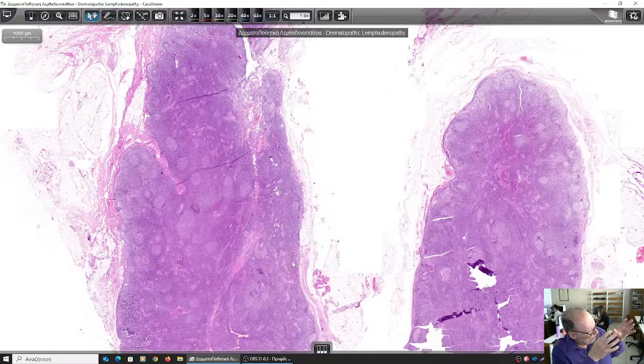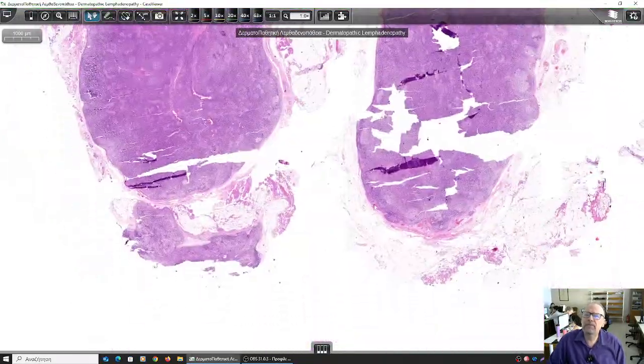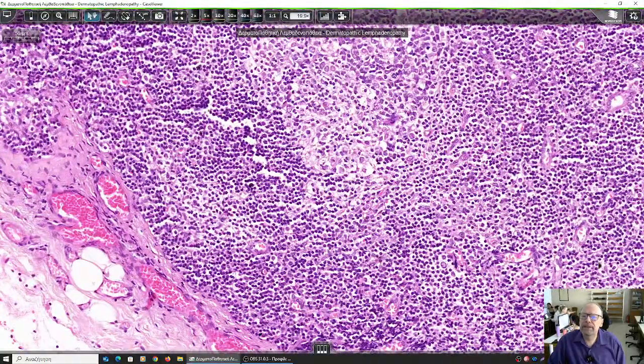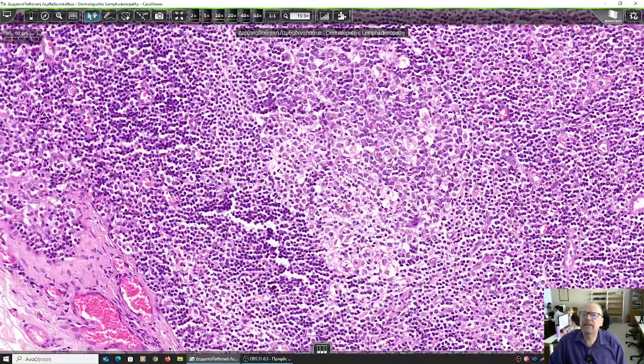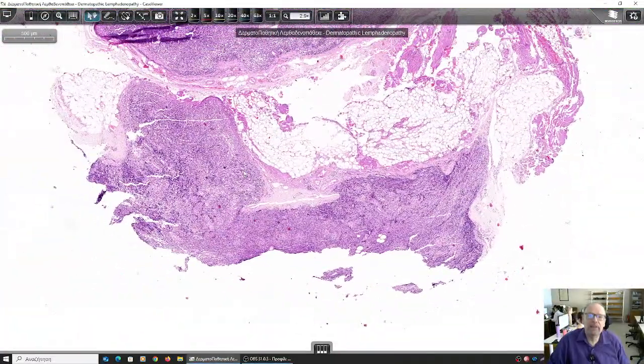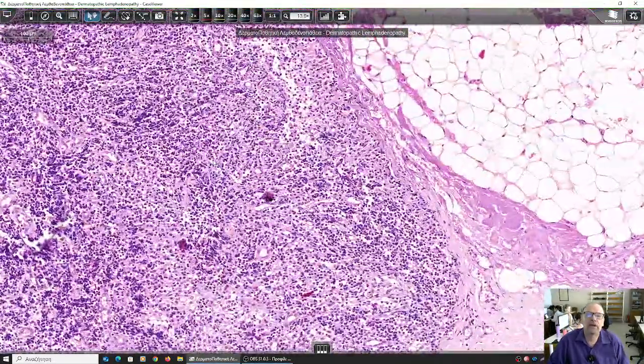And if you see the distribution of the immunopositivity, it will be like the normal lymph node. So there is some distortion in the architecture, but not severe enough to justify the diagnosis of a lymphoma. I expected to be able to find the melanin pigment, which might raise suspicions, of course, of a melanoma metastasis, which is not the case, because these are not melanocytes.